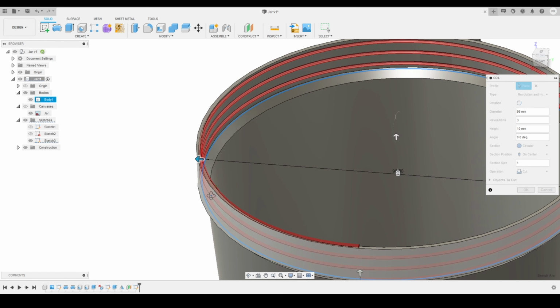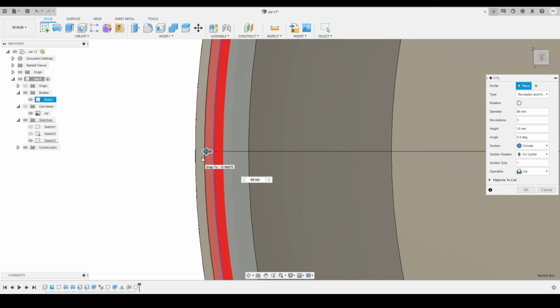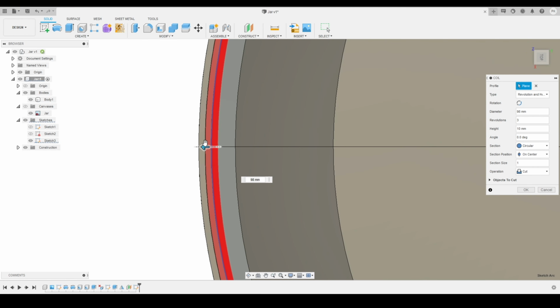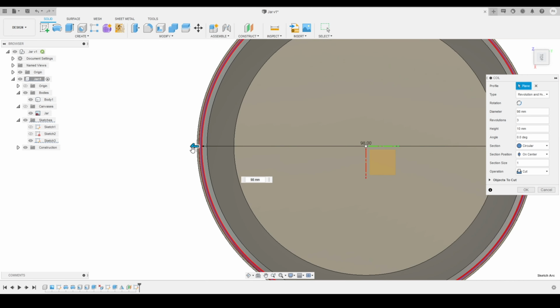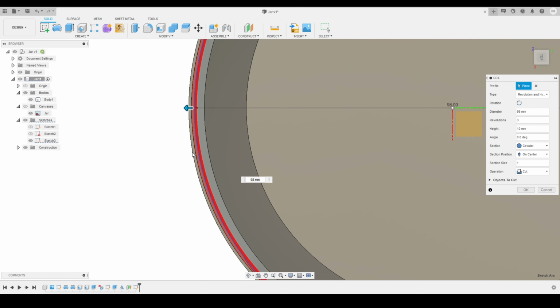And here you can see now I'm getting a little preview of the thing that we needed, and if I zoom in on the area, I will be able to see that half is inside the body whereas half is on the inside that's apart from our body. So this is the preview we are getting, and I think this is what we wanted. So it is looking good for now.